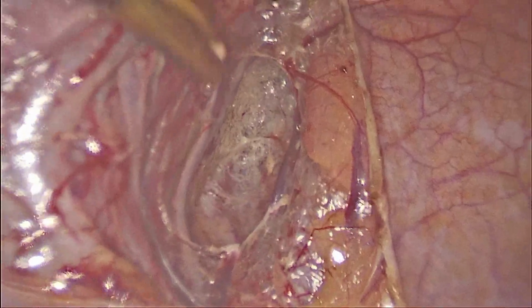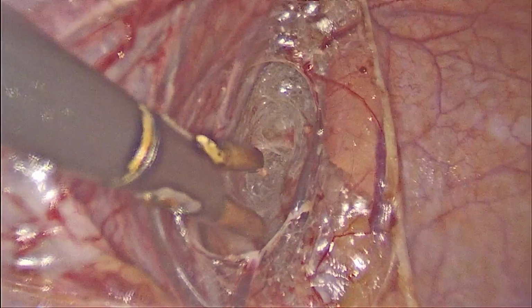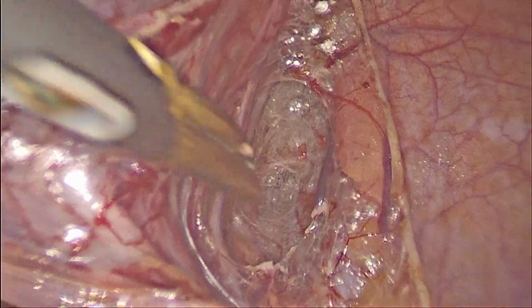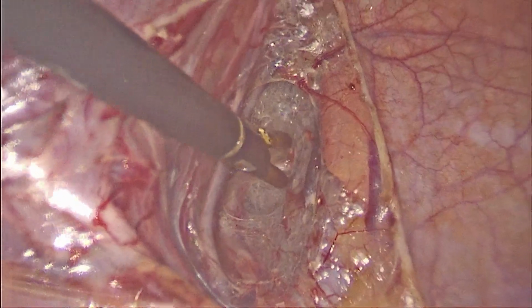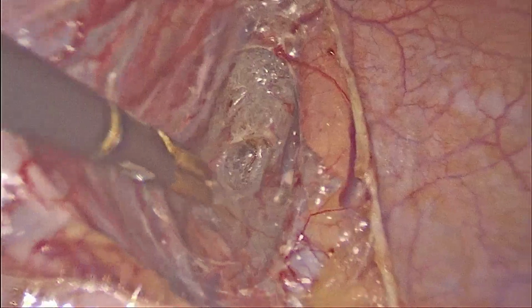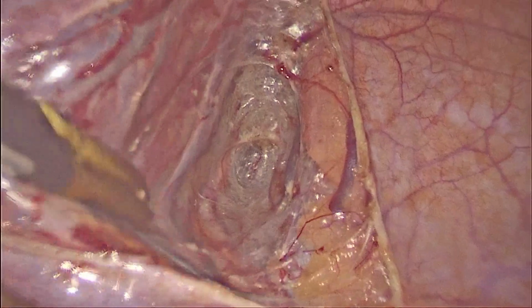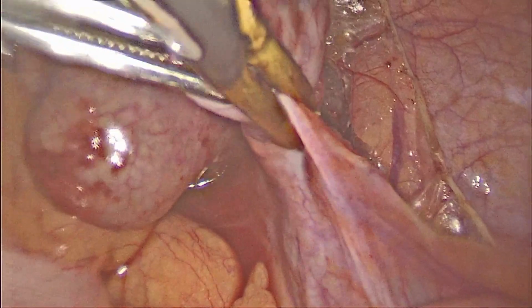Especially when a patient has distorted anatomy, many a time the ureter may be well away from the site of surgery, but it is a good practice to identify the ureter in its course and keep it safe. That is the only way to save the ureter during surgery, especially in cases like this where dense adhesions are anticipated.